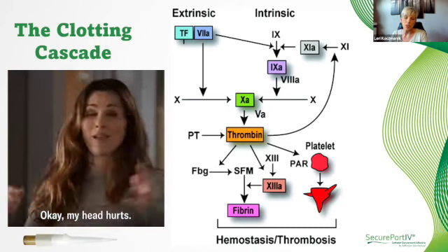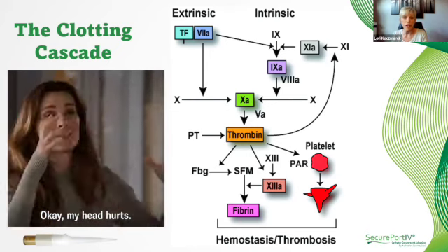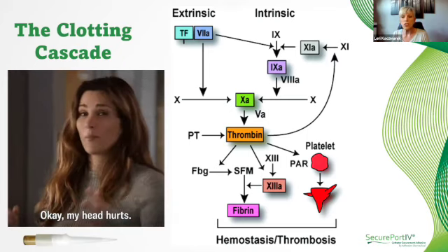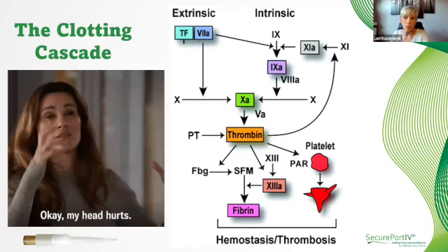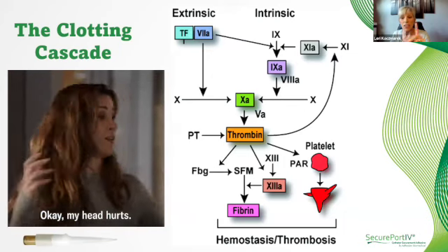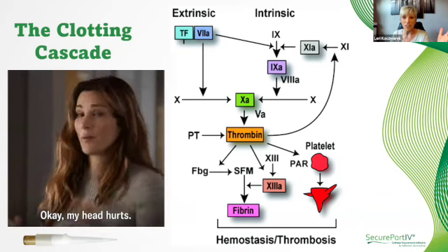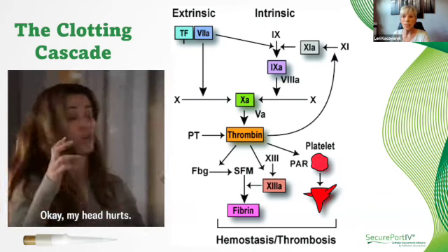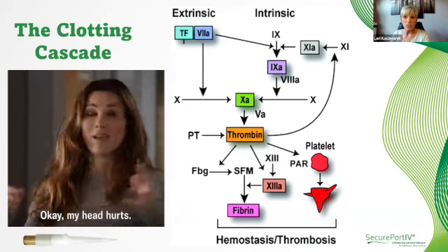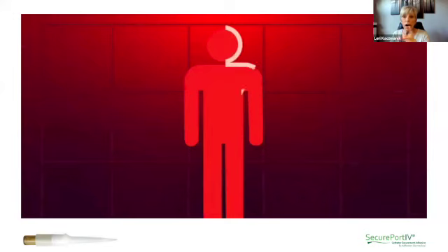Doing that assessment piece is really key, and we talk about this on the Vascular Access Facebook page. What do we do about the INR, the PTT, the platelets? What's the safest device? We do a good job assessing that, but there are still challenges with patients having post-insertion bleeding and oozing. What's significant now, and even 2 weeks ago when we had the first IV League learning talking about hospital onset bacteremia, is that we really need to pay attention to all of our devices and address the issues of bleeding and oozing with all of our catheters, because that's putting our patients at risk.